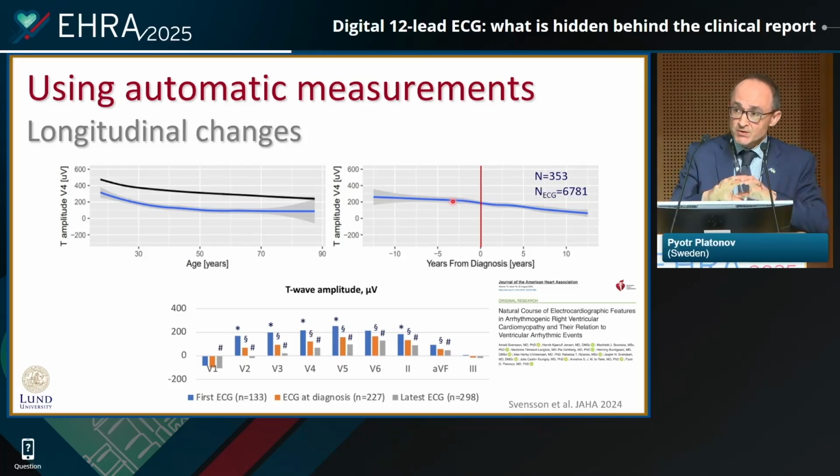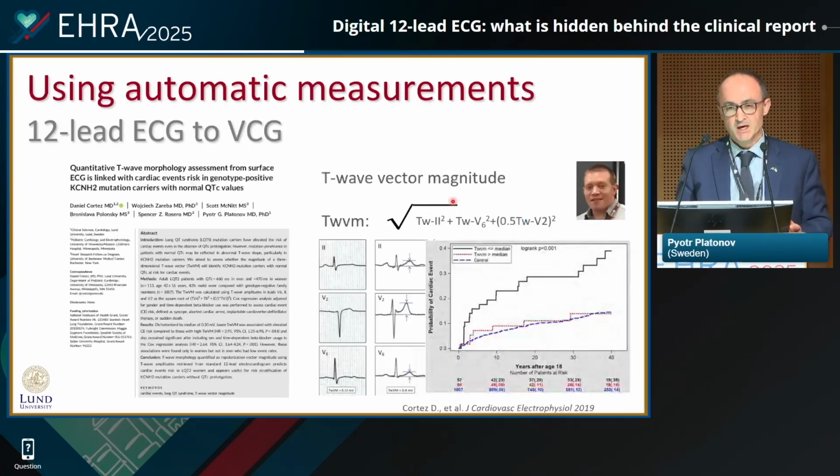So that information comes from the digital ECG archive. Easily retrievable, standard processing, you just get the numbers, you pull the data, and you can have the answer. Unbelievably important information source. Another way to work on the measurements is to calculate indices based on the automatic measurements.